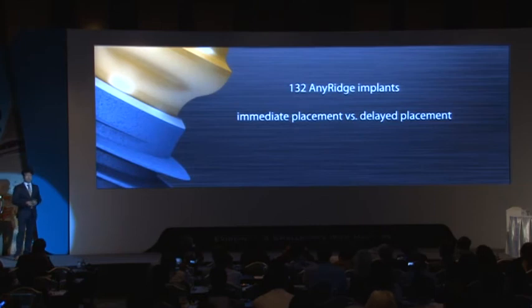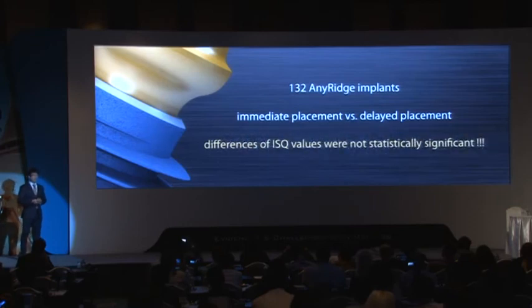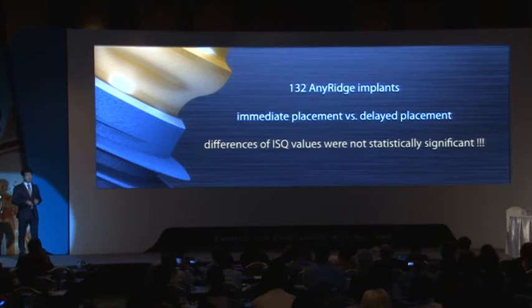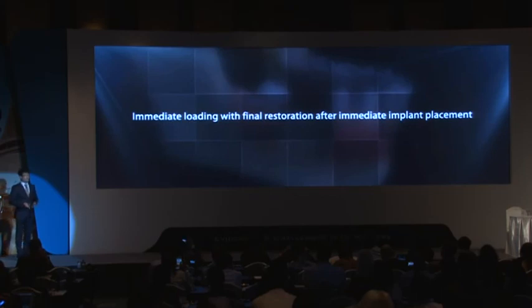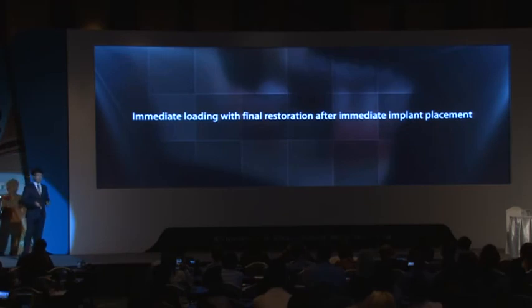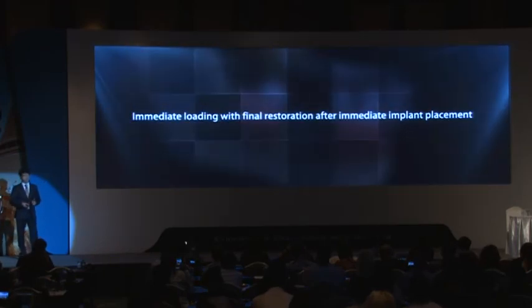I reviewed my data about ISQ values of Anyridge, and there were no statistically significant differences of ISQ values between immediate implant placement and delayed implant placement. So I'm trying immediate loading after immediate implant placement with the final prosthesis these days. Let's see this video.